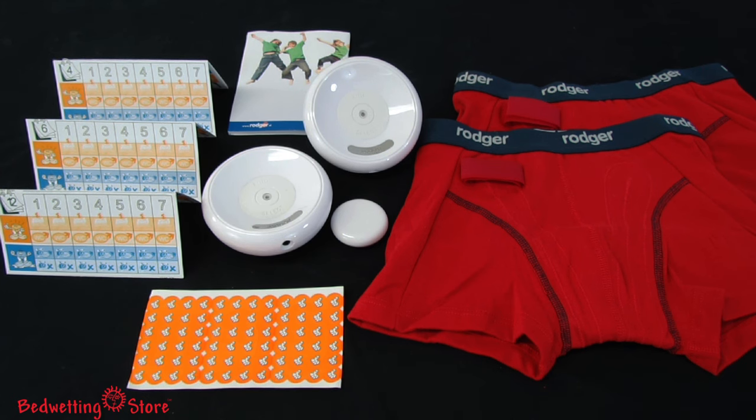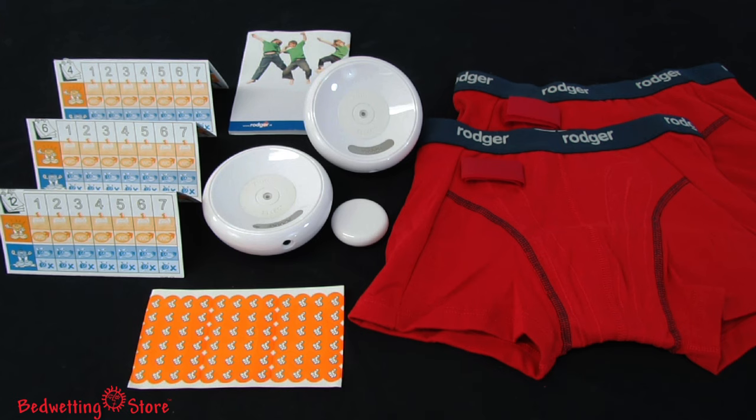This unique and reliable alarm includes two pairs of machine wash and dry moisture sensing underwear, one or two receivers, a transmitter with a sealed battery, and a progress chart with success stickers.